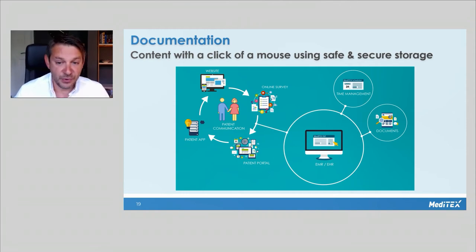Documentation. It is important for all documents related to a patient to be saved in one central location and visible to staff with the right access permissions. It can be used for document control to ensure the current versions are available to be used. It can use a digital signature of a staff member to approve a document before it is formally sent to the patient. You can use these documentation management systems to locate documents easier by searching for a specific type of document, such as consents, prescriptions, blood test results, etc., rather than sorting through every sheet of paper in the traditional paper record.